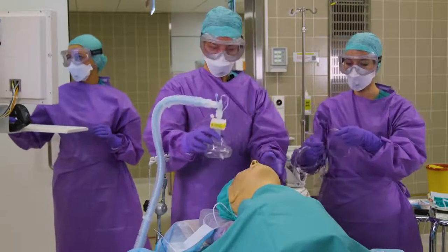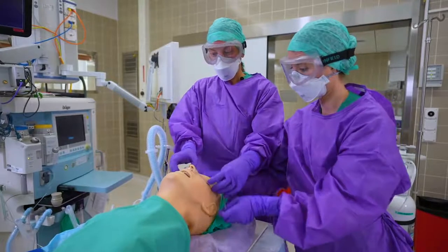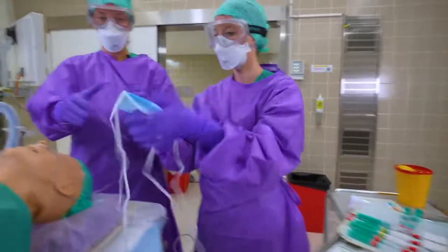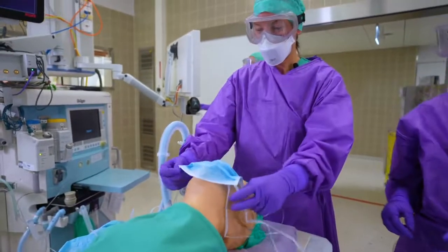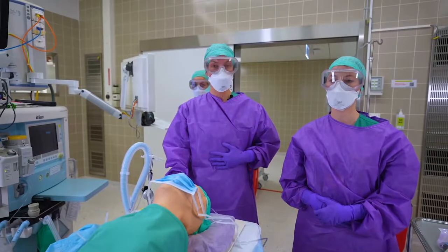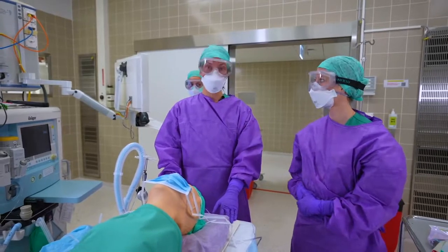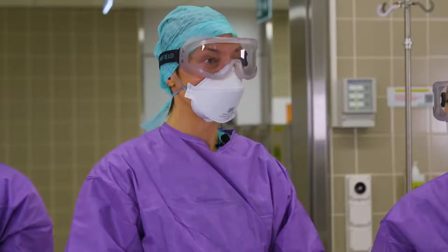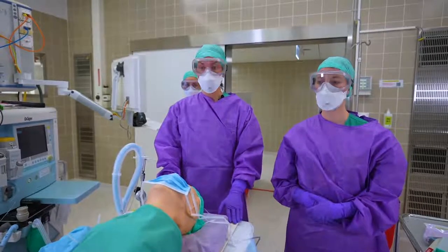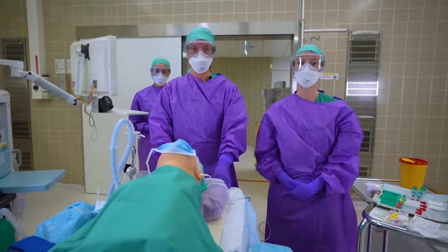After the nasal prongs are on the patient, the patient will also receive a surgical face mask. After successful extubation, it is important to doff your personal protective equipment according to your local standard operational procedures. A body check is important. We also recommend debriefings after intubation and extubation to further optimize your procedure. Be safe and stay healthy out there. Good luck.